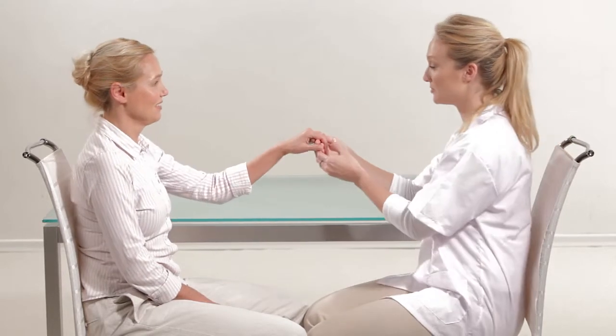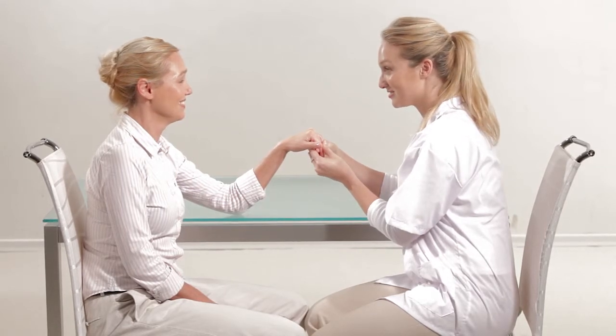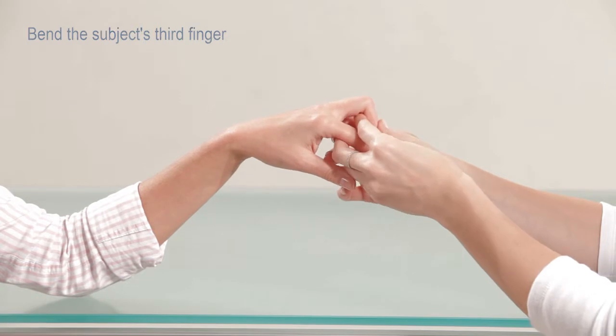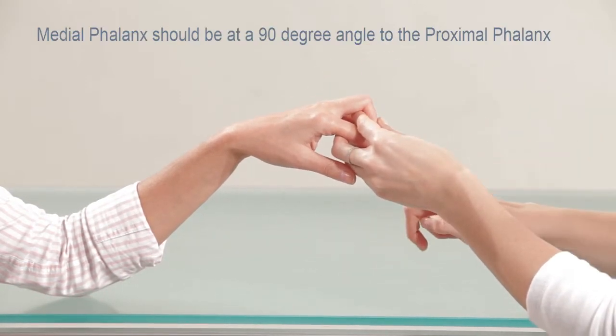To measure the third phalanx, the subject should be seated opposite the operator and next to a standard desk. The hand should be placed on the desk as close as possible to the operator. Bend the subject's third finger so the medial phalanx is at a 90-degree angle to the proximal phalanx.